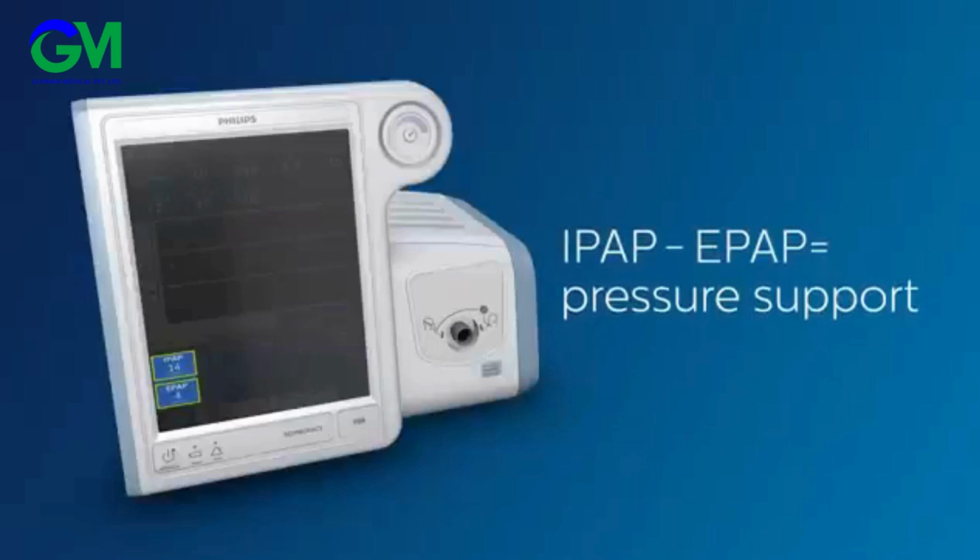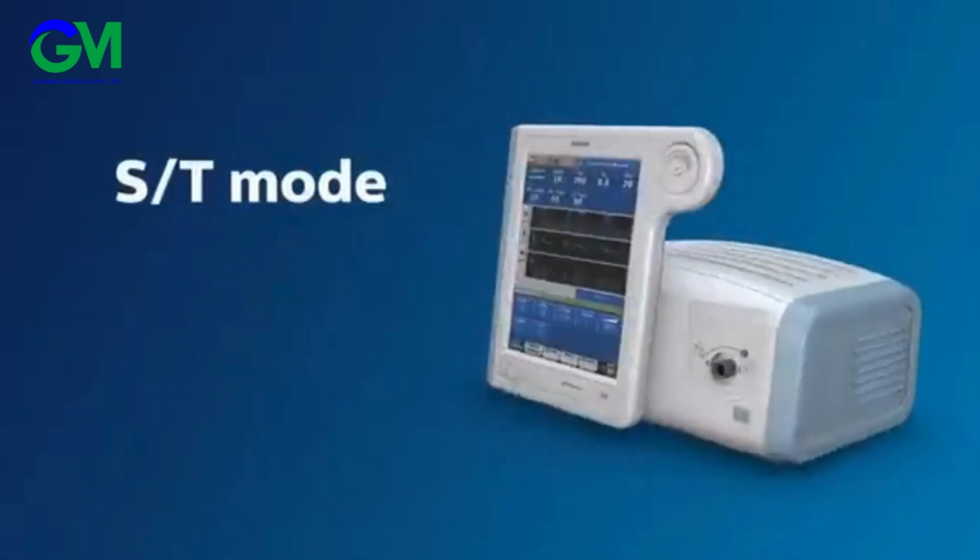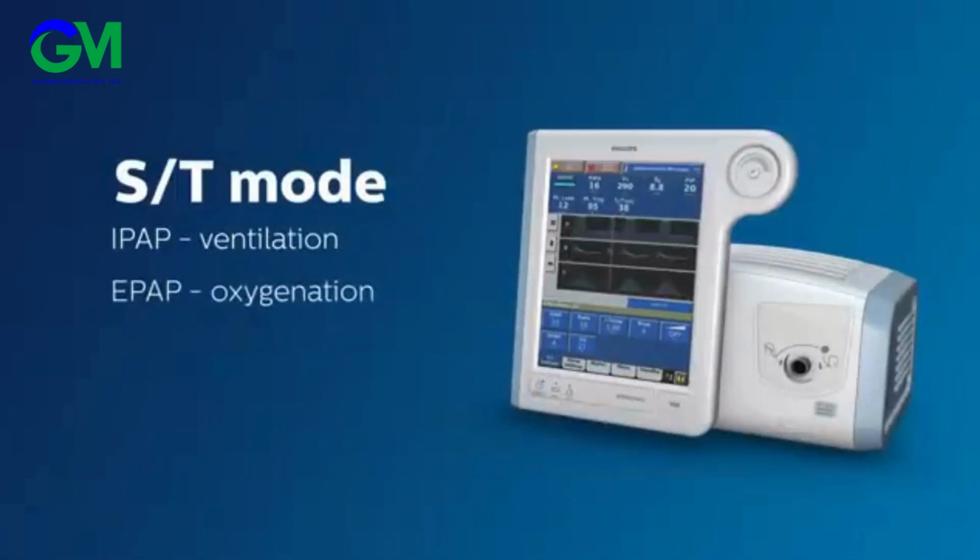The difference between the IPAP and EPAP is pressure support. In the example provided here, the pressure support given to the patient is 10 centimeters of water, because IPAP of 14 minus the EPAP of 4 equals 10. In this mode, you have one IPAP setting, one EPAP setting, and therefore one fixed pressure support.